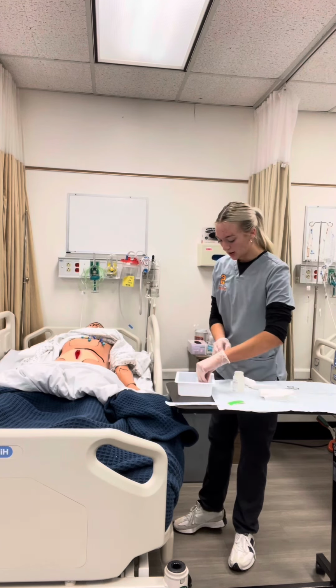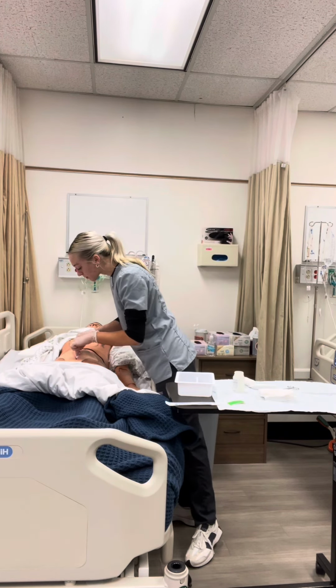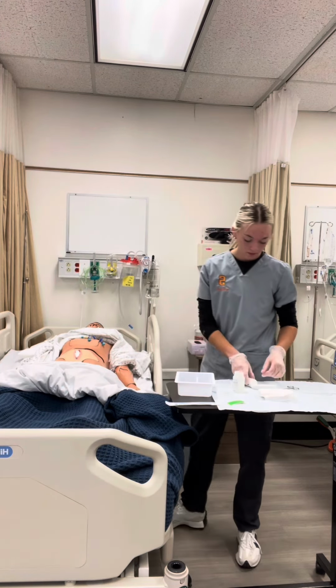And I'm going to wring out any excess fluid. And I don't want my hands to touch the edge of the wound either.